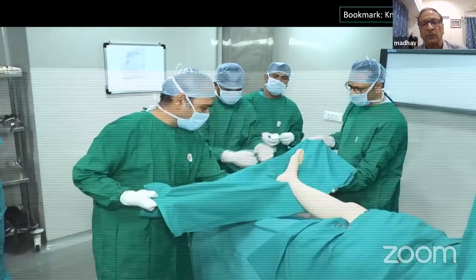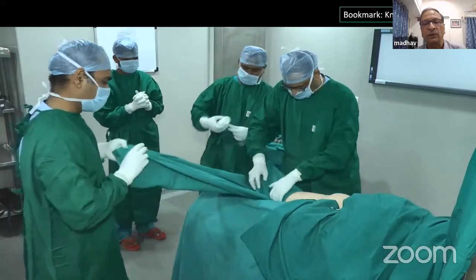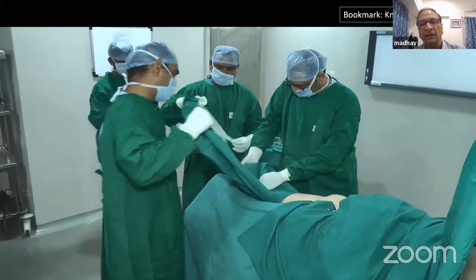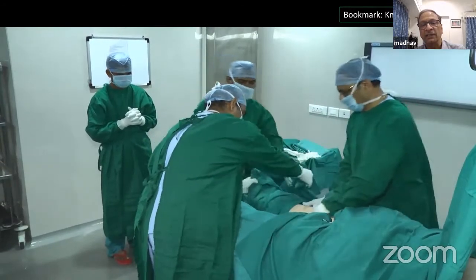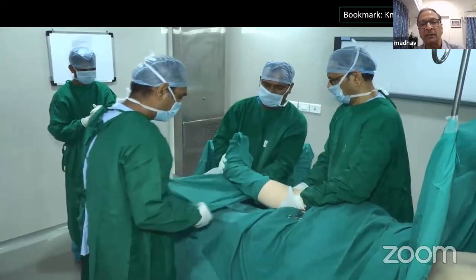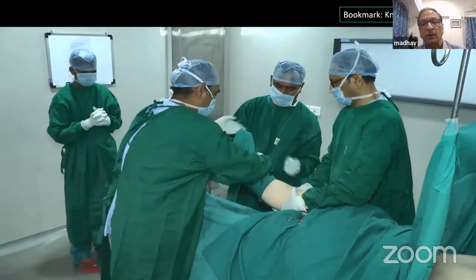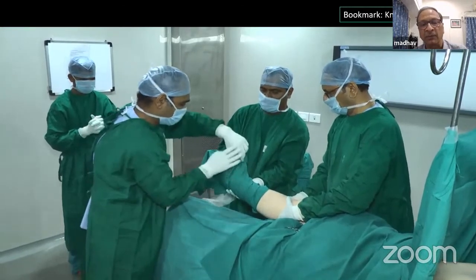So there you go. So here, instead of a mop, you have taken a big sheet and you have covered the foot, ankle, and the lower third of the leg in the sheet, which you will secure in place with either a clean wrap or a roller bandage, depending on the availability.